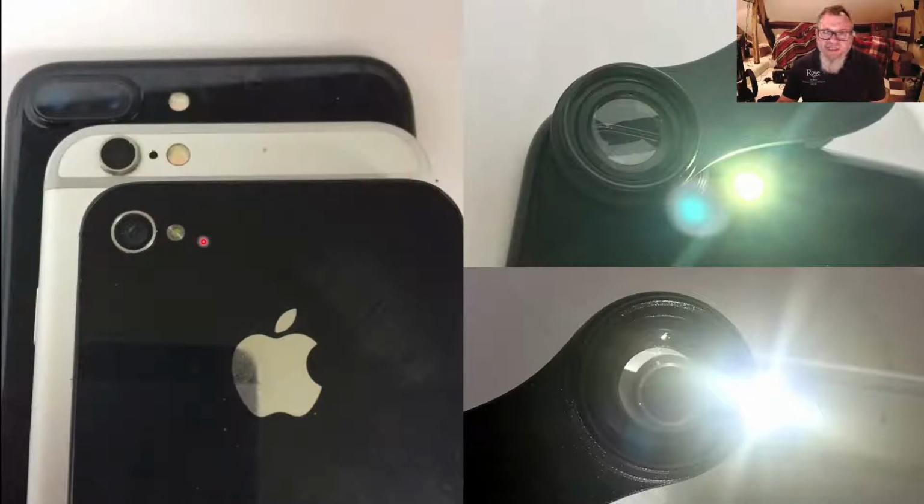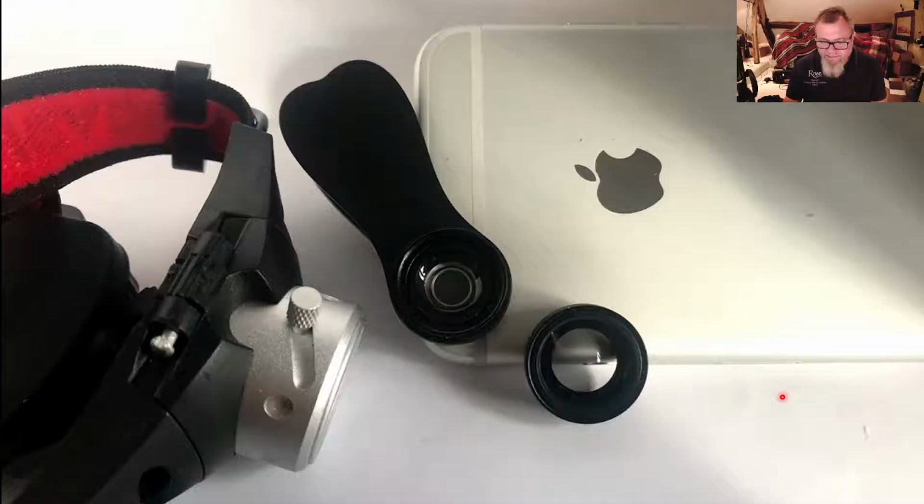These are a series of iPhones, just again to illustrate how close together the lens and light are on the iPhone 4, and it's a big difference in all these phones. And if it's a long distance like the 7 Plus, you can use the macro lens and still use the on-camera light. But with the iPhone 6, this is too close and it gets in the way. Often losing the on-camera light isn't as big a problem as you might imagine, because having light obliquely is often more useful than having light in the same direction when you're doing macro photography.